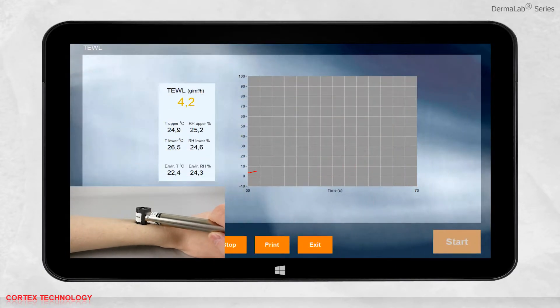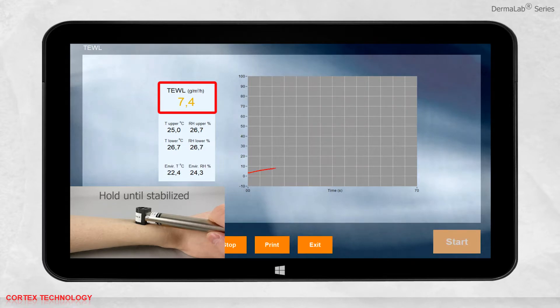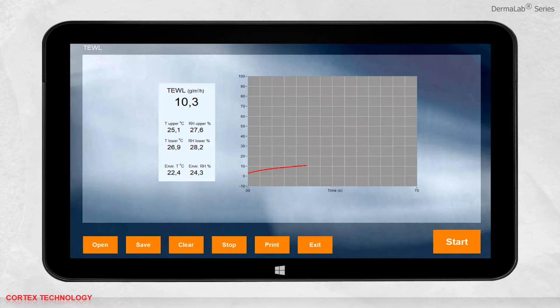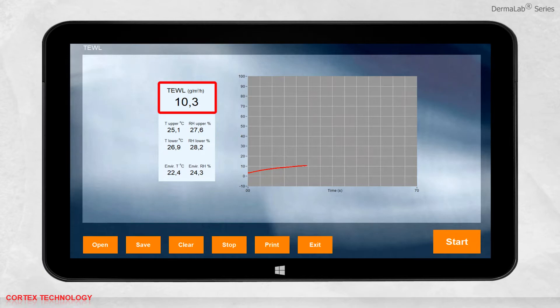When the display turns black, the measurement has stabilized and stops with a standard deviation of 0.2. Evaporation loss is presented in grams per square meter per hour.